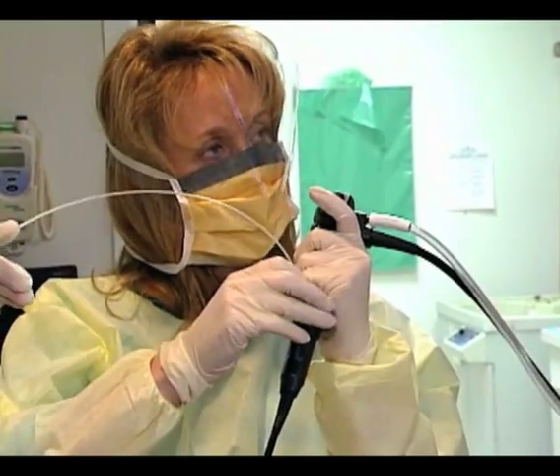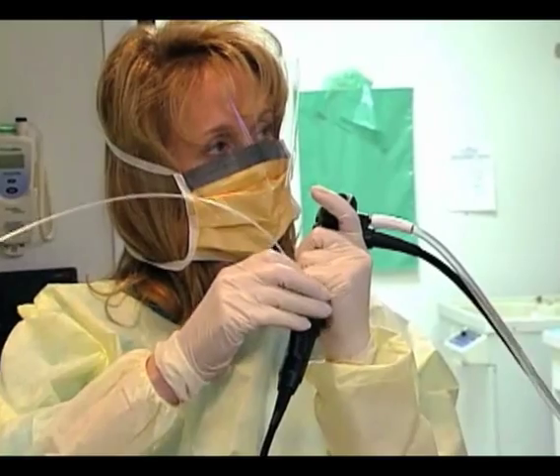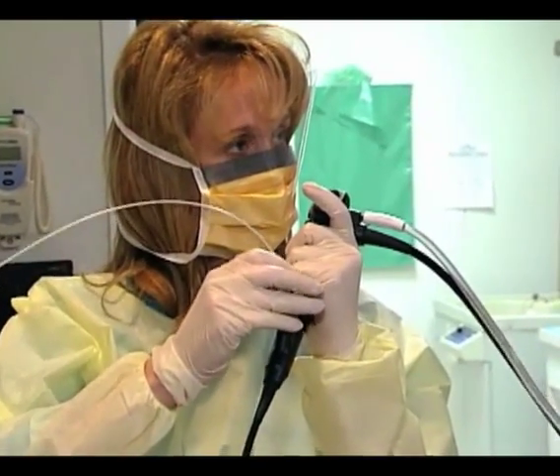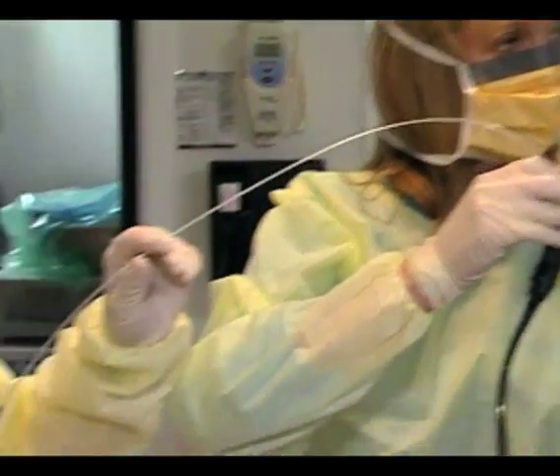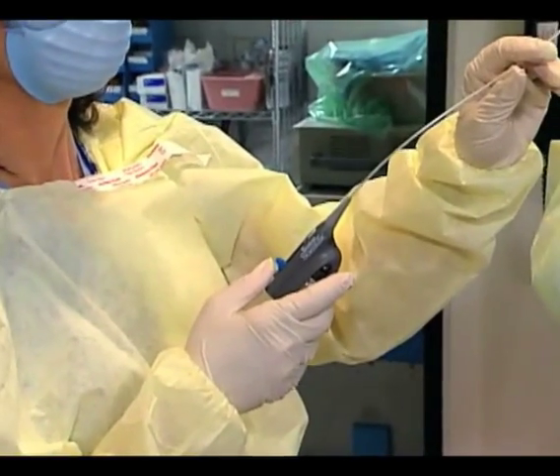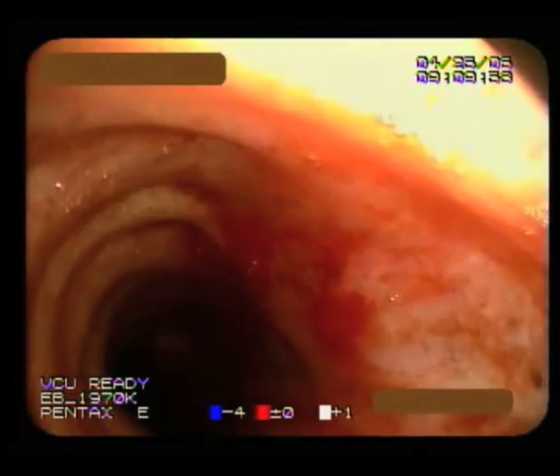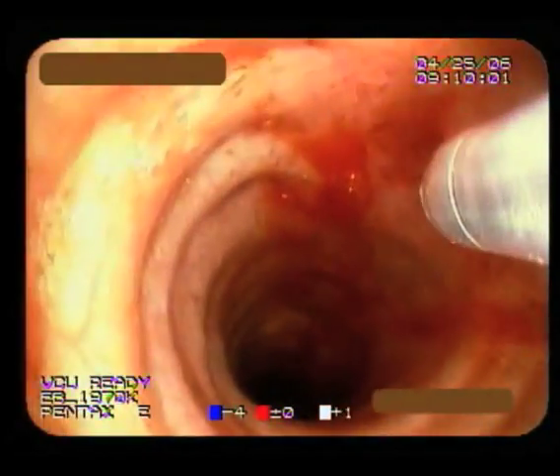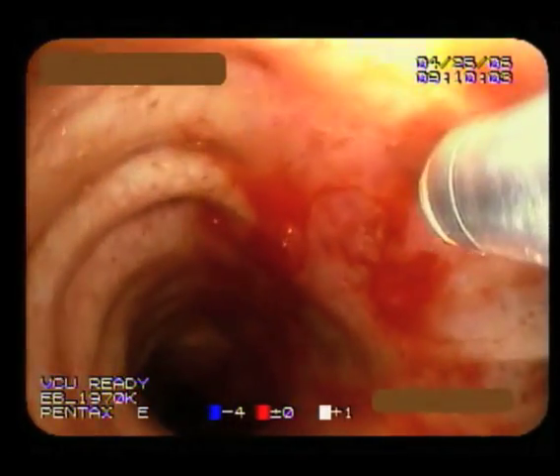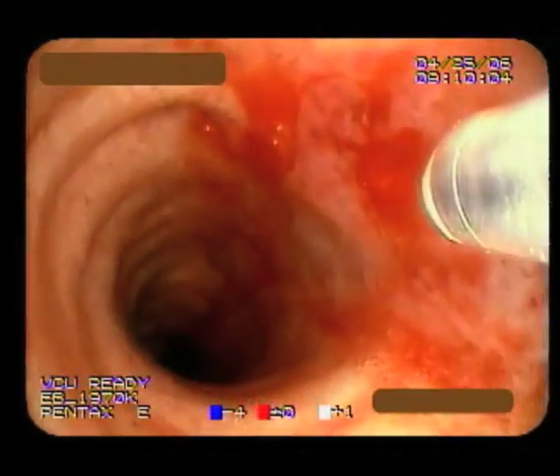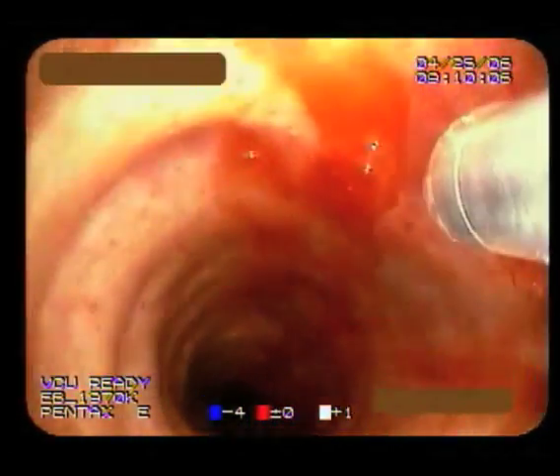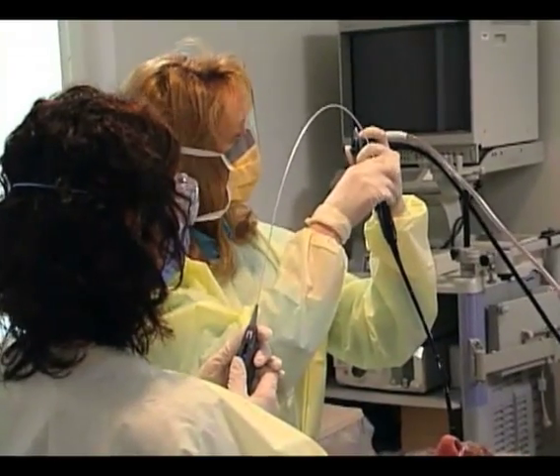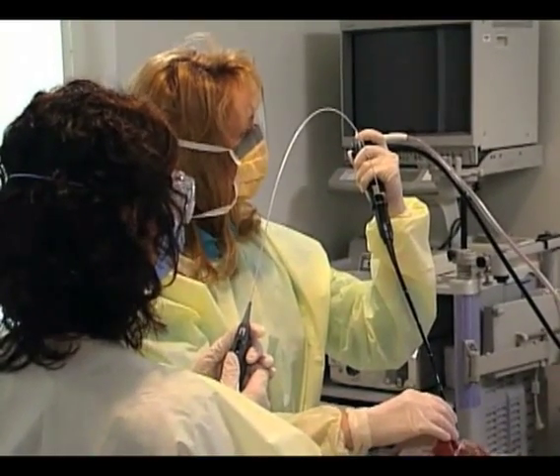Another benefit with this needle is that it has durability. I can make multiple passes without kinking of the guide wire and the stylet, which allows me to be effective in taking more biopsies. If you have cytopathology on site, another option is you may have your answer with the first pass.